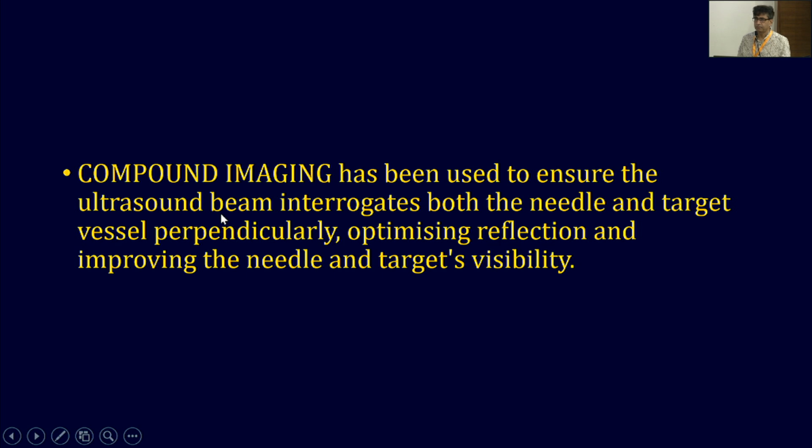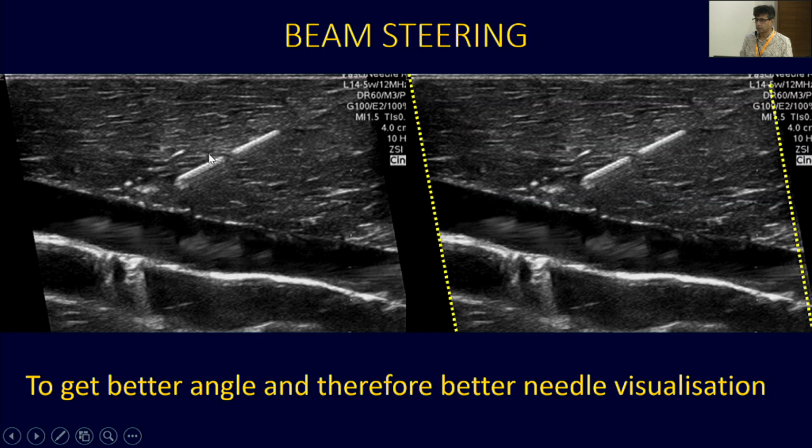Compound imaging allows the beam to be fired from several lines of sight. So you get the beam firing from several angles, and this is a big advantage when you are doing interventional procedures. So use of compound imaging should be made, and you can also steer the beam in the direction of the needle so that you get a greater angle, and when you get a better angle, the needle visualization will be better.